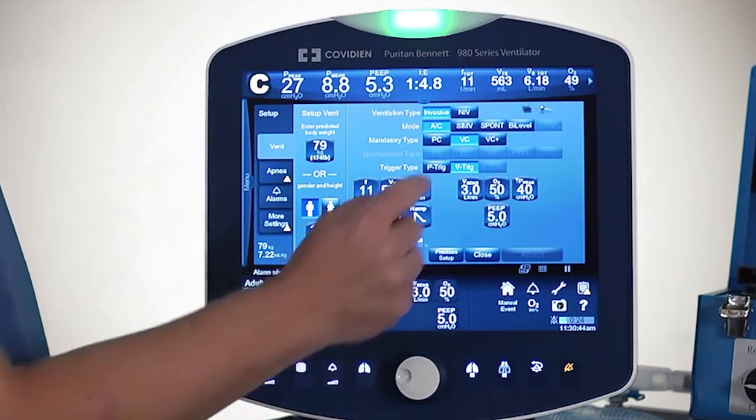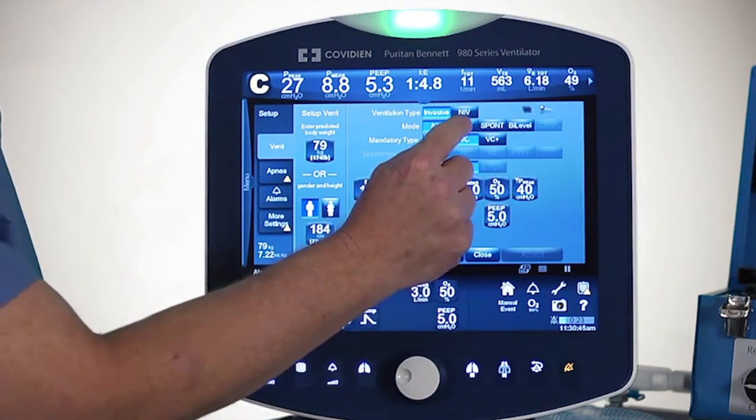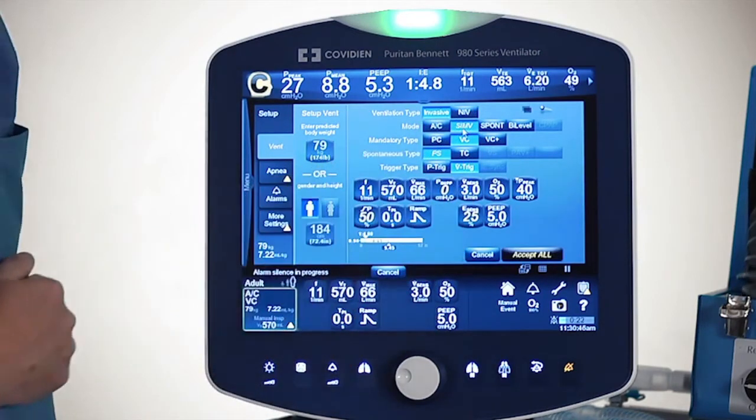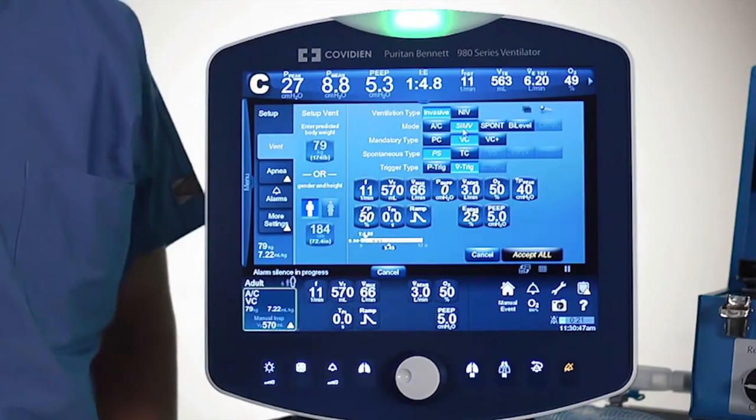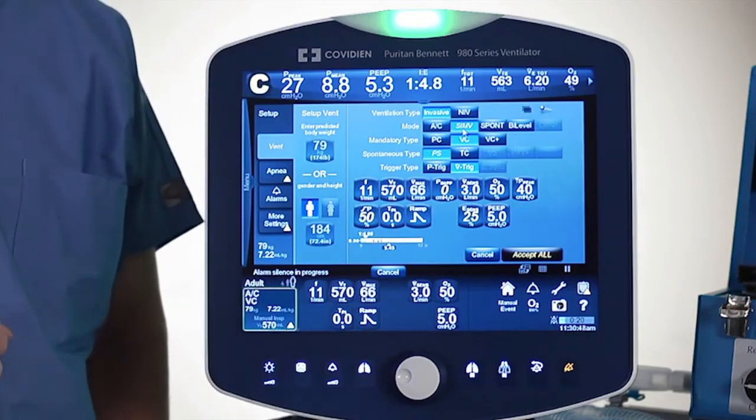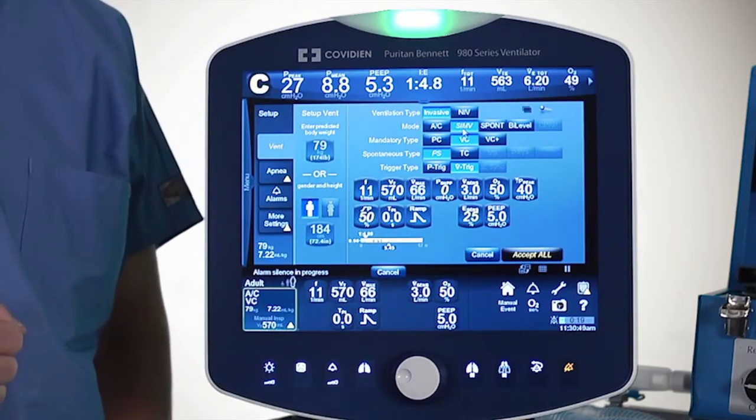For example, if I wanted to go to SIMV, I can simply change that and go to the new mode of ventilation.